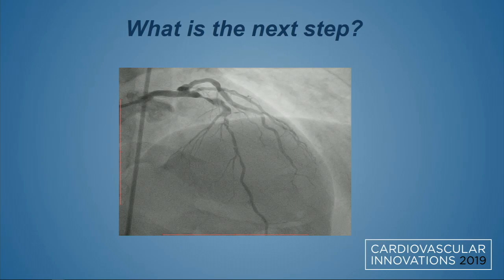Because you stopped. And I think you did the right thing about stopping and thinking through the case once you've reestablished flow. Also, the patient had collateral flow anyway. Also, that suggests that it is an aneurysm. Look at the proximal to the aneurysm, it's very tapered. What size stent did you put? You put a 3?